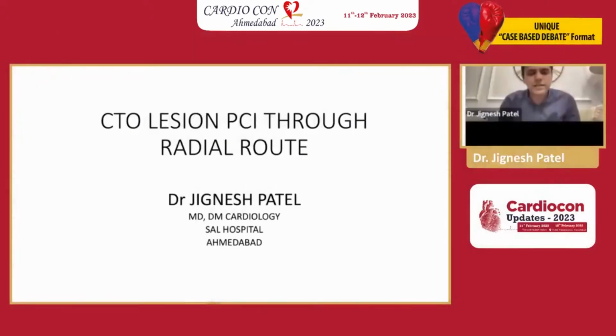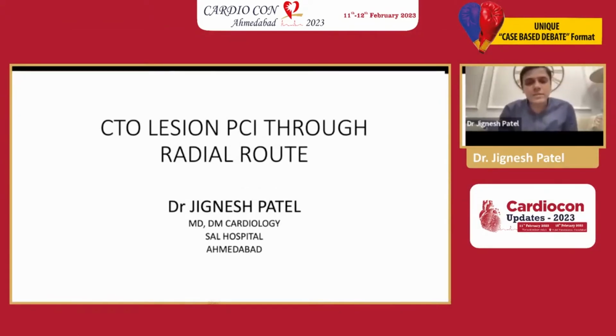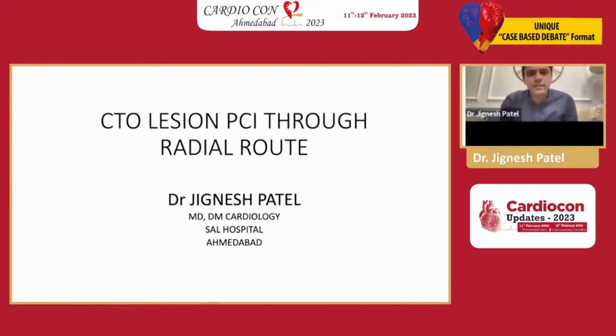As the toughest case, I am going to present a very bad-looking CTO lesion PCI through the radial route. This is really very tough for me because I did this case in my first year of interventional cardiology practice at the Sal Hospital. So, I am presenting this today.